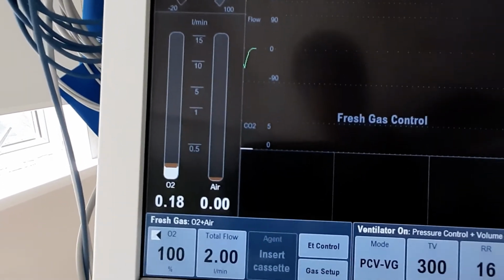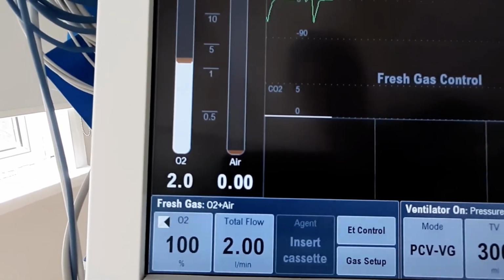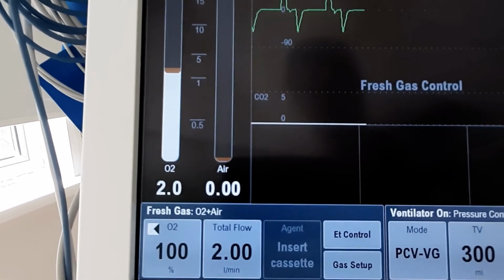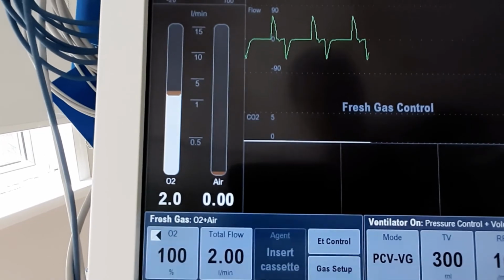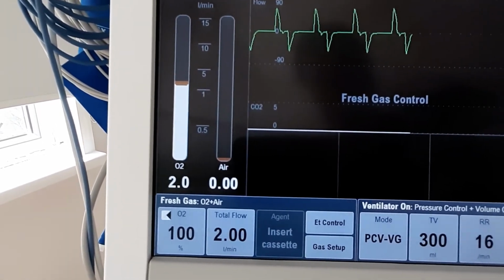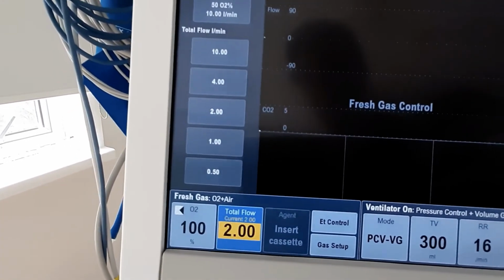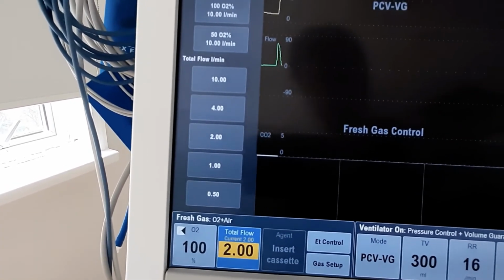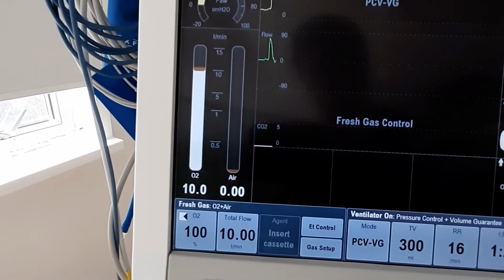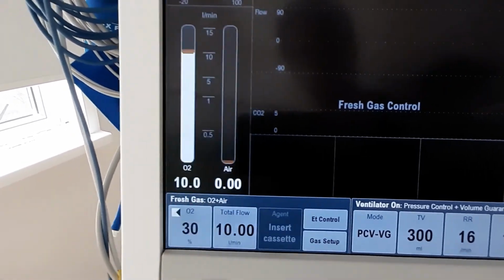It is very important to note that the machine defaults back to a flow of 2 liters per minute and 100% oxygen. This flow is too low to prevent rebreathing of carbon dioxide in intensive care use when soda lime is not part of the circle system. We therefore need to increase it again back to the previous levels. If you're in a hurry, just press the 10 liters per minute button. The FiO2 can then also be adjusted either with the buttons or with a green wheel.